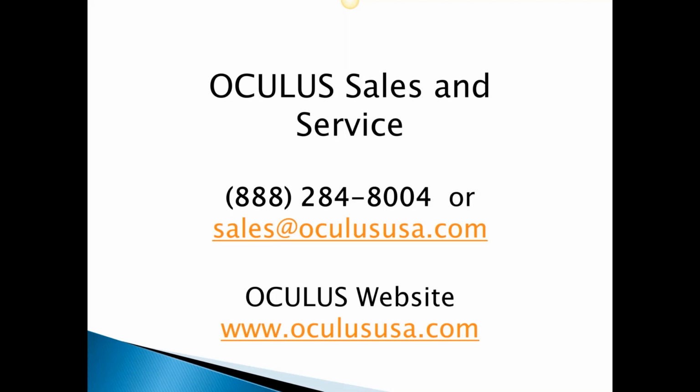And first of all, it alleviates the problems in how long it takes to get the scans, as well as ultimately how good a scan you're going to get. And yeah, six months I wasted time, and I could not possibly get a decent scan by myself. And so when I finally resigned myself to another set of hands, that's when my scans really started getting fantastic.